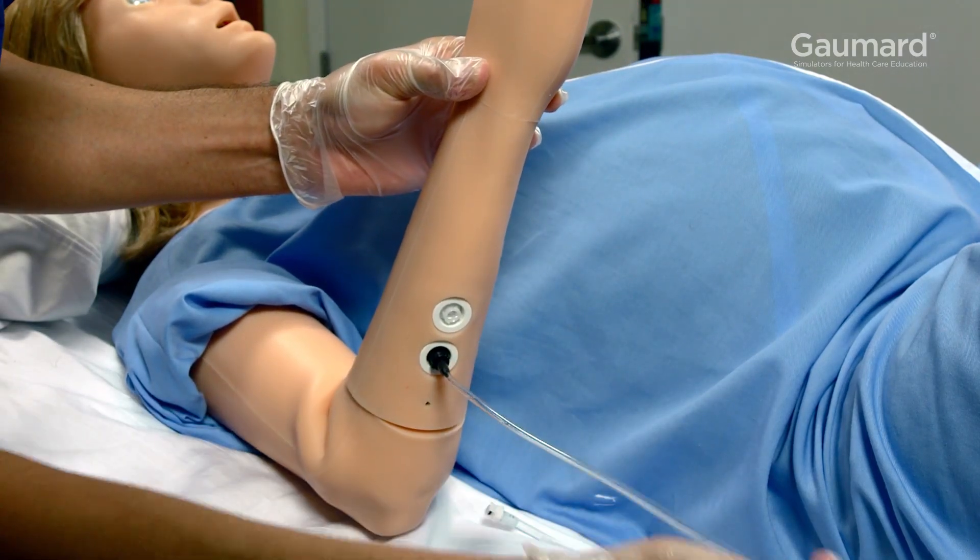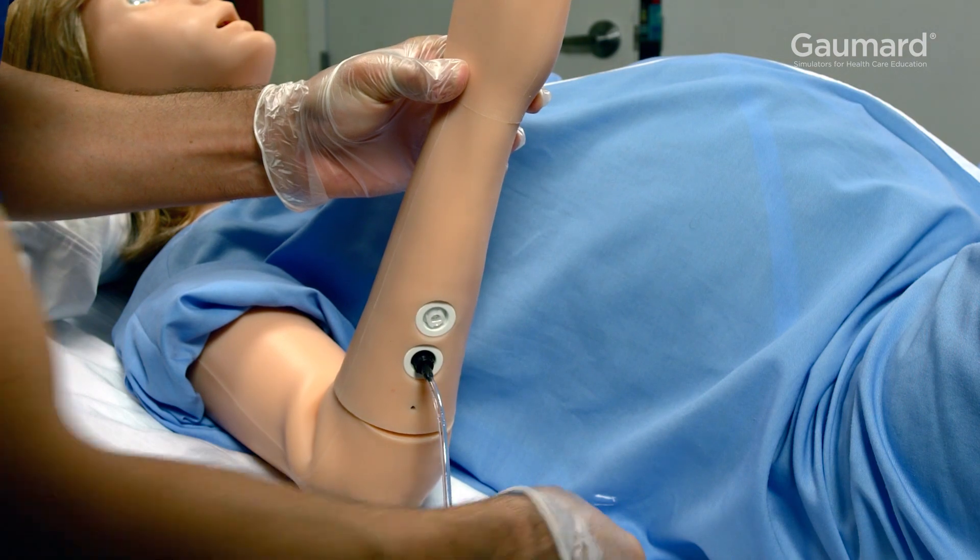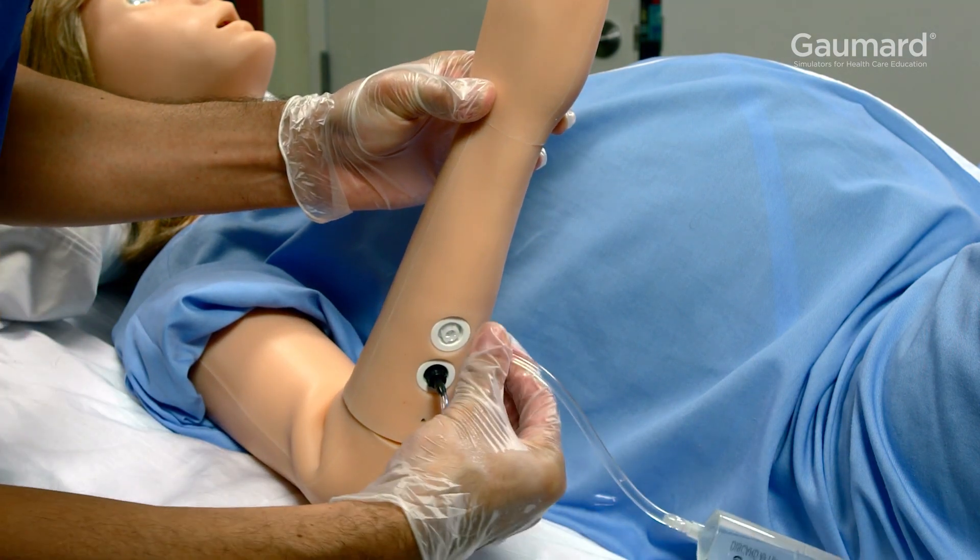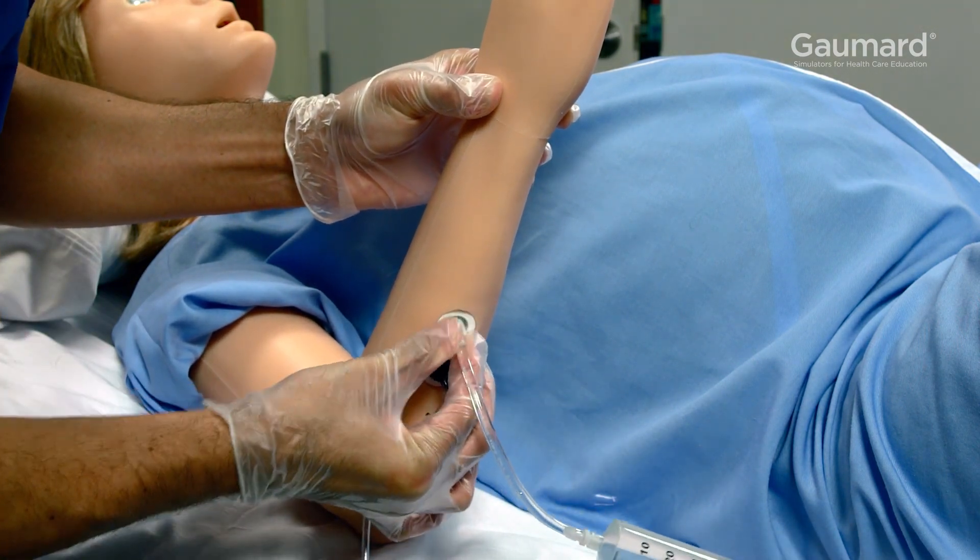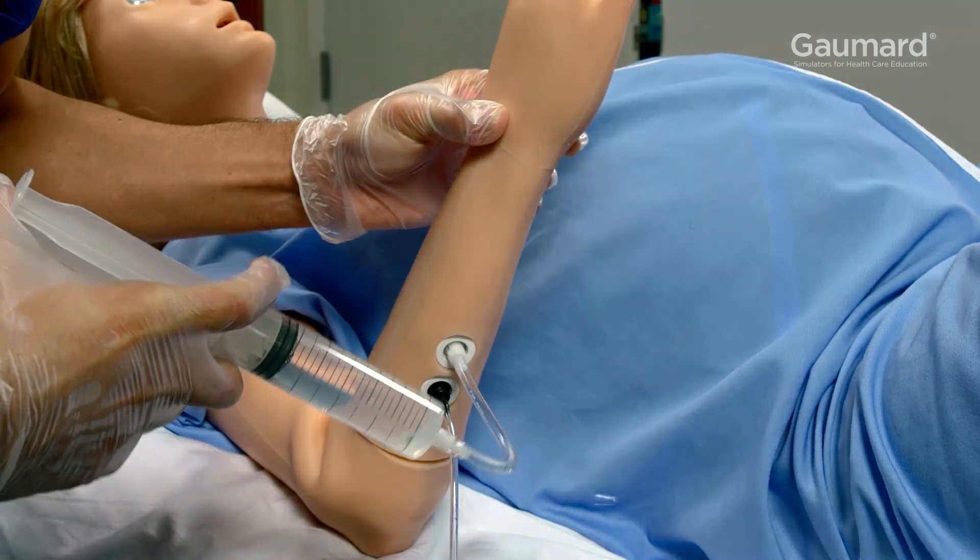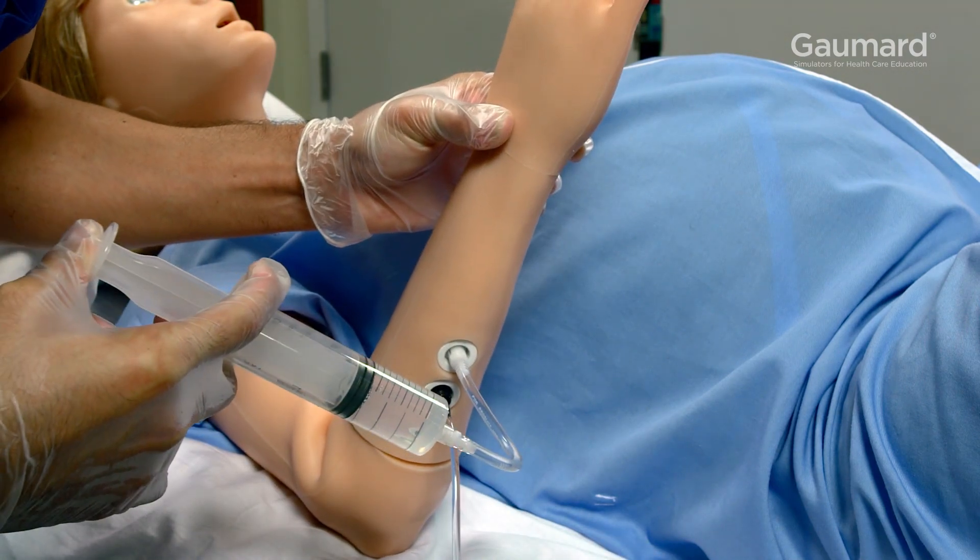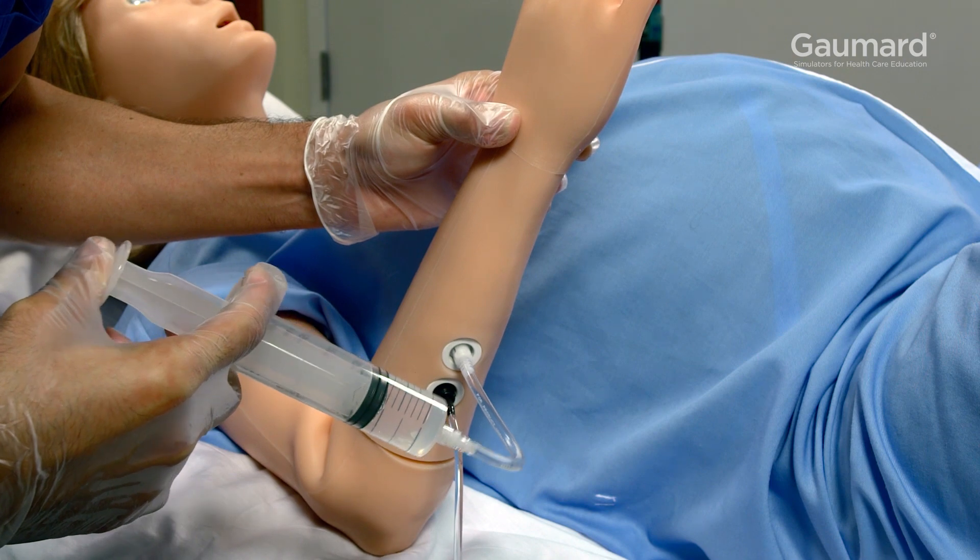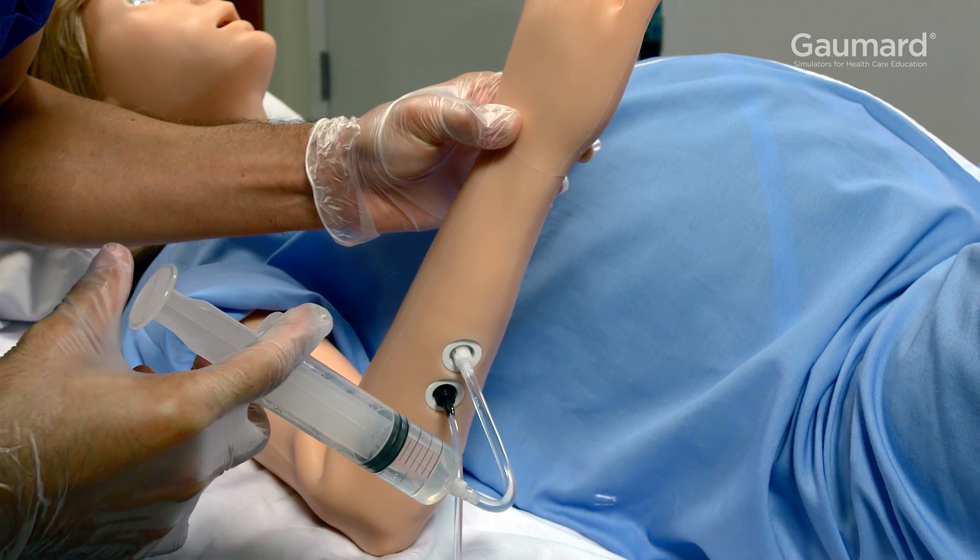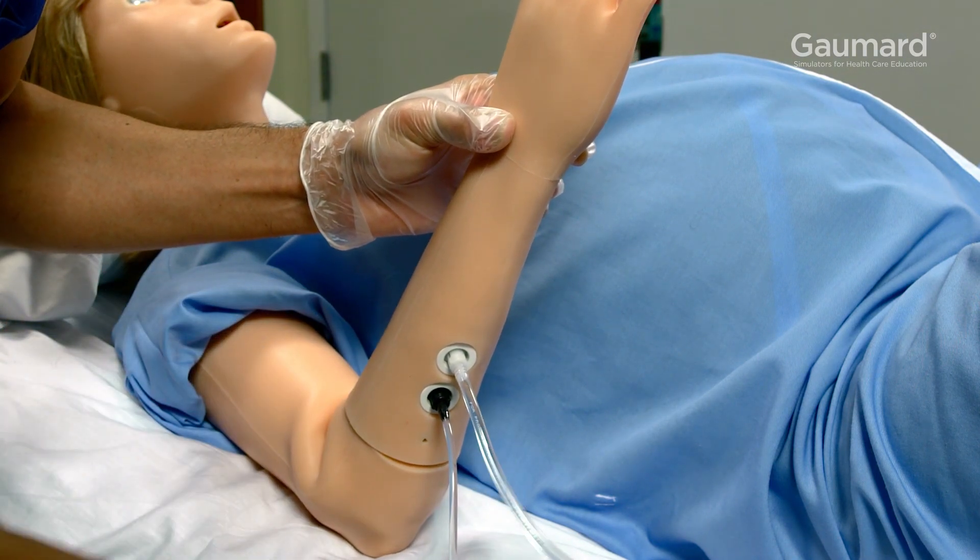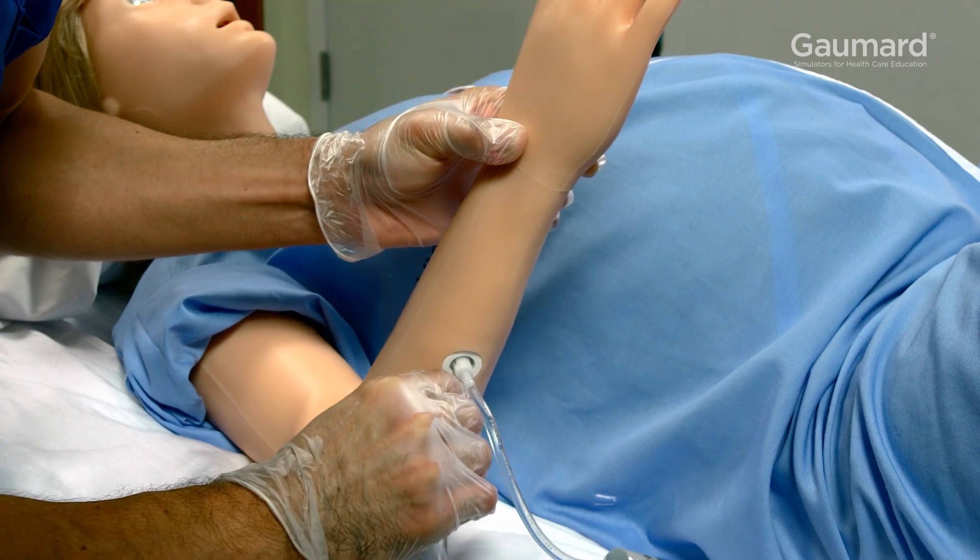Connect a lure lock drain hose to the drain port on the arm and position the drain line into a fluid container. Connect the white lure lock of the IV filling kit to the white filling port. Use the IV filling kit to push fluids through the arm until the drain hose is clear of air bubbles. Then disconnect both lines.